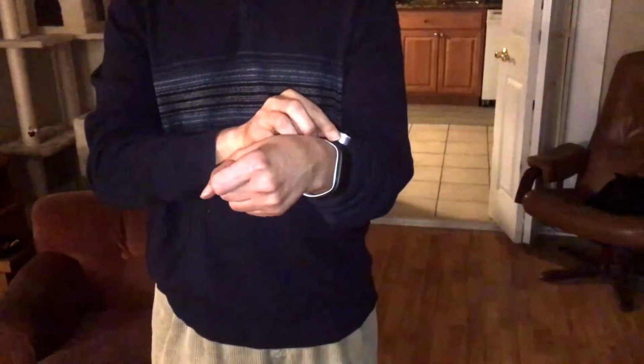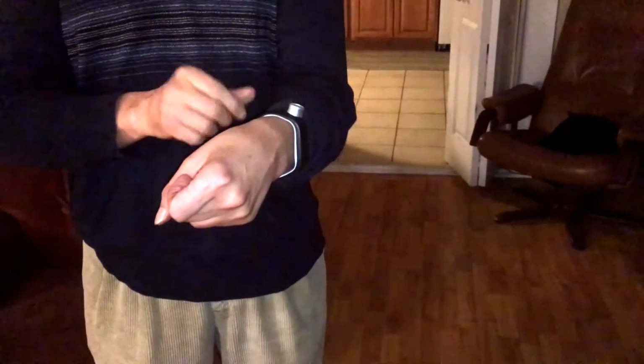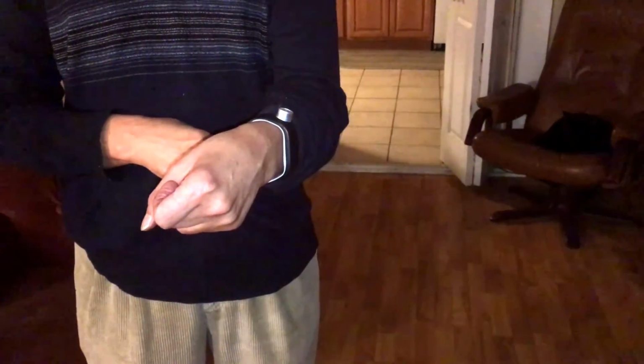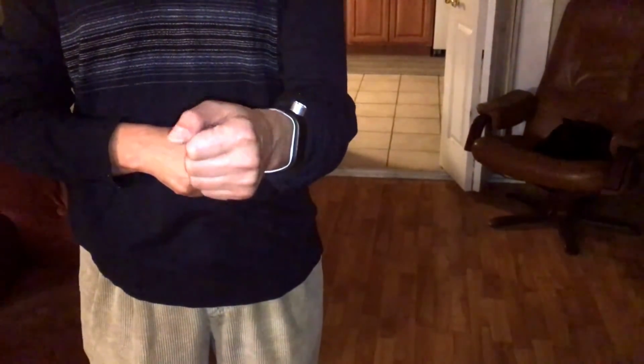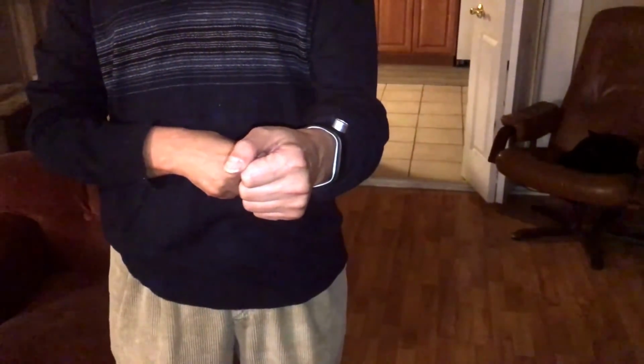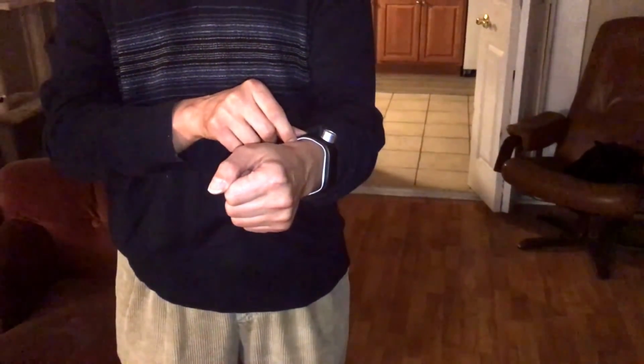If you point the device directly upward, it knows and it stops vibrating because it assumes that you don't want to be looking directly up at the sky. So if for whatever reason you have your hand oriented a certain way, maybe you have it resting on a table or what have you, the device will not be continuously nagging you about the ceiling. Then when you return your arm to its natural position, the device knows and it recalibrates itself and begins its detection.